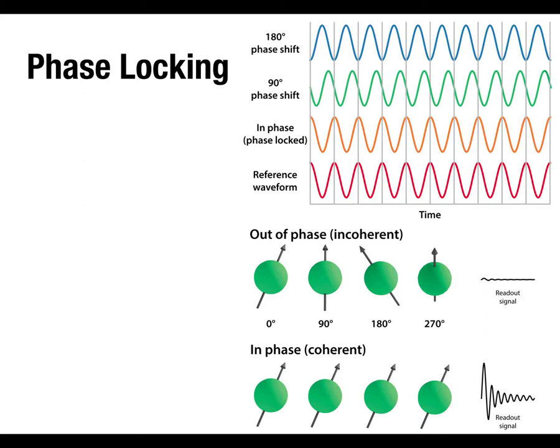What happens is when you send in the RF pulse, they all phase lock to that RF pulse. So you're sending in energy at exactly the speed that they're already oscillating, and you're basically pulling them all into alignment. If some have to speed up or slow down to get there, they'll do that. So again, the music analogy is good there, right?